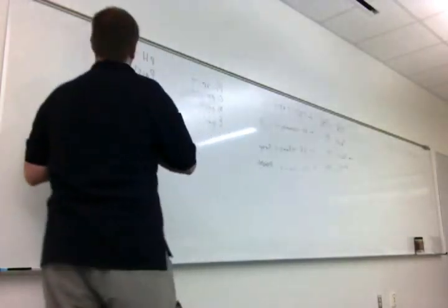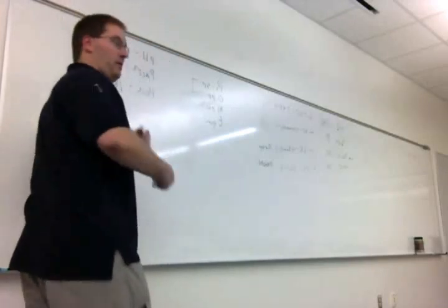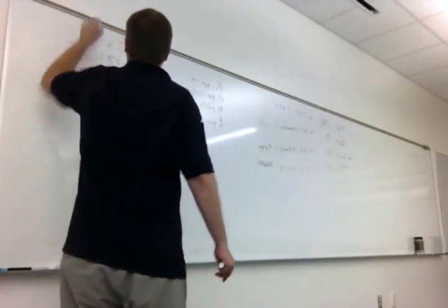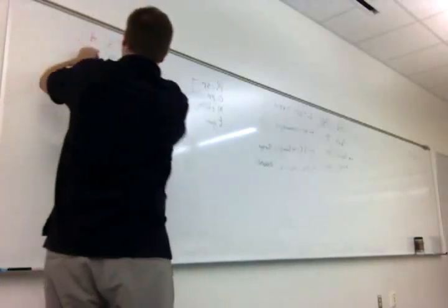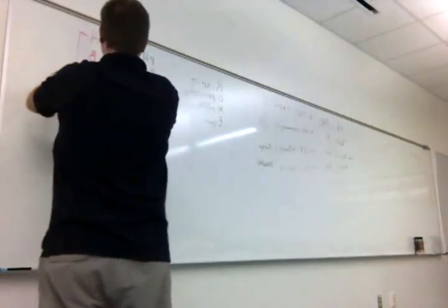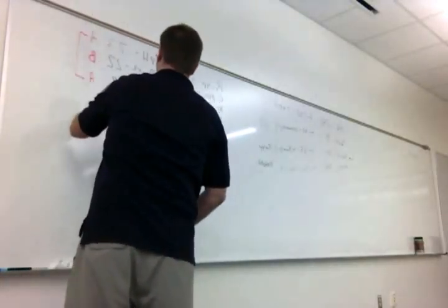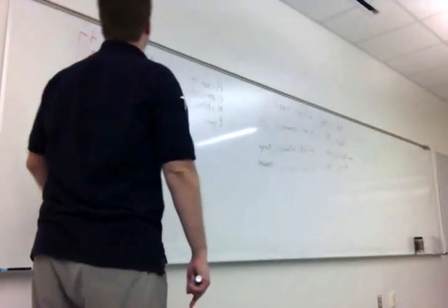Okay, so again, start at the pH. Acid, base, or normal? 7.3 is acid. CO2, acid, base, or normal? Base, because it's low. Bicarb, acid, base, or normal? Acid. So connect the dots. What is this? This is a metabolic acidosis. Is there compensation?